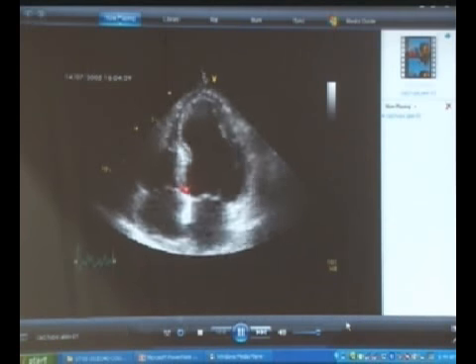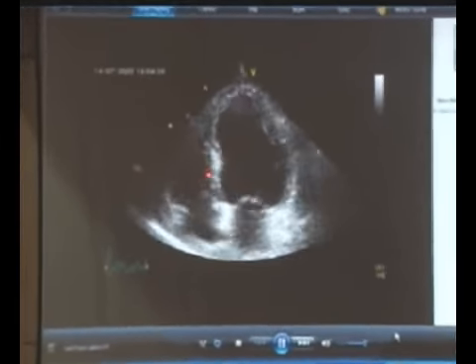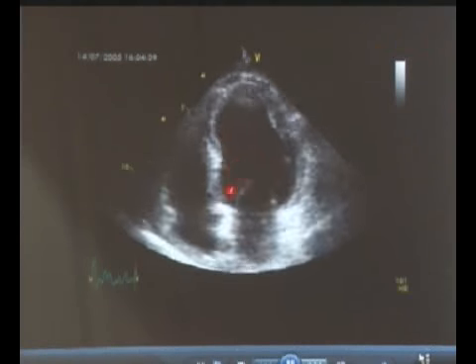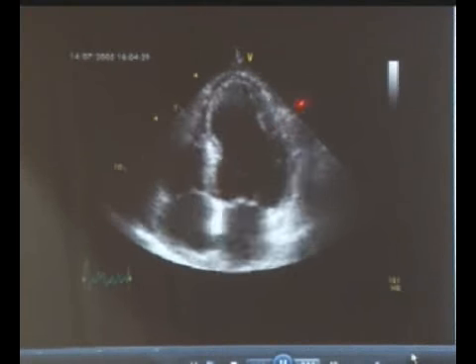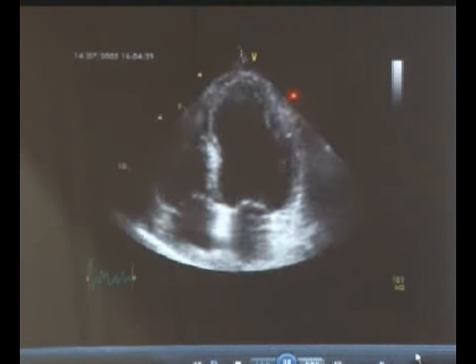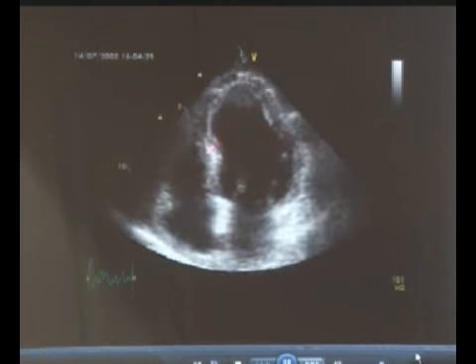No, I am not saying everything is contracting, somebody less, somebody more. My question is, what does it show you now? Normokinetic, hypokinetic or dyskinetic? It appears hypokinetic if I compare with this segment. However, if I compare this segment with this segment, it still appears hypokinetic. And in this format, this segment is possibly a normokinetic segment, right? If you compare this segment with this, it appears to be hyperkinetic.